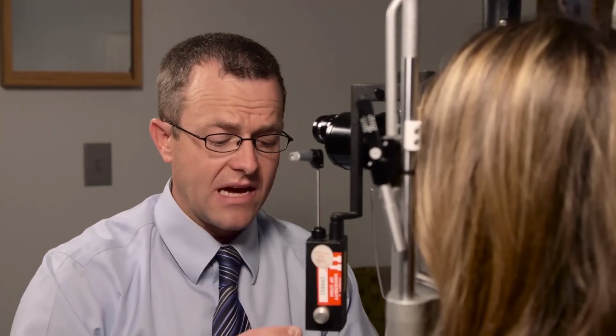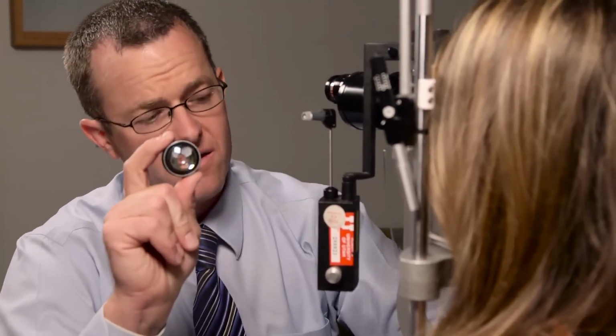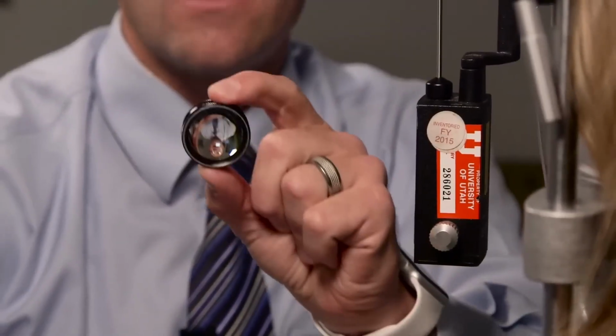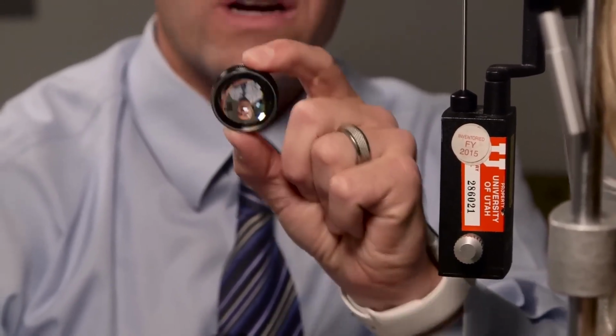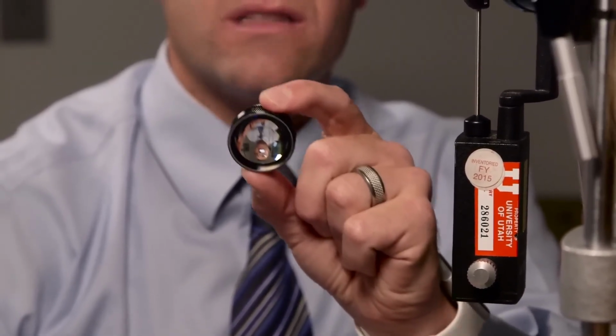Commonly, there are two main types of lenses that you'll use. The purpose of lenses in doing a retina exam is to be able to magnify the images in the back of the eye. The common ones that are used are a 78 diopter lens and a 90 diopter lens. I'm using a 78 diopter lens. And there are some little tricks to be able to pick up the posterior segment of the eye or the retina using this lens.